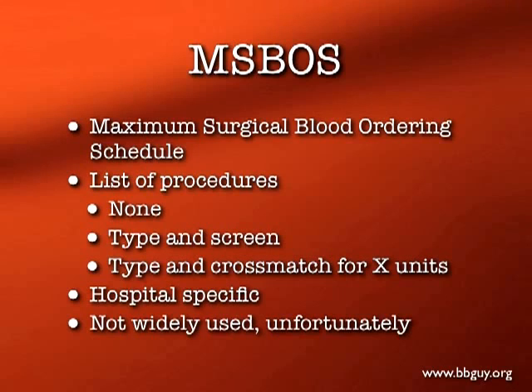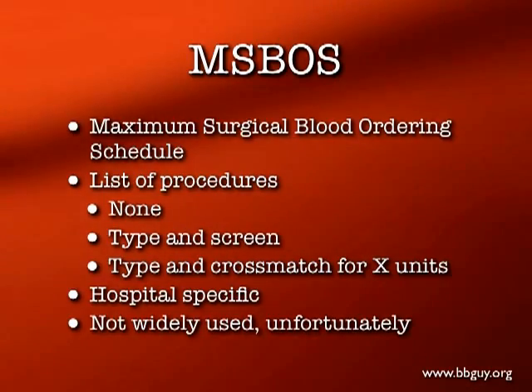especially in situations where people are ordering types and crosses, for example, when they should be ordering types and screens. But unfortunately, it's not nearly as widely used as it used to be. It's a little bit of a hassle. In fact, in many cases, it's a lot of a hassle.